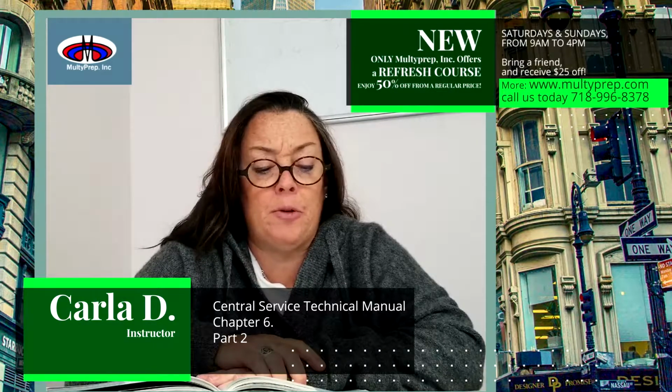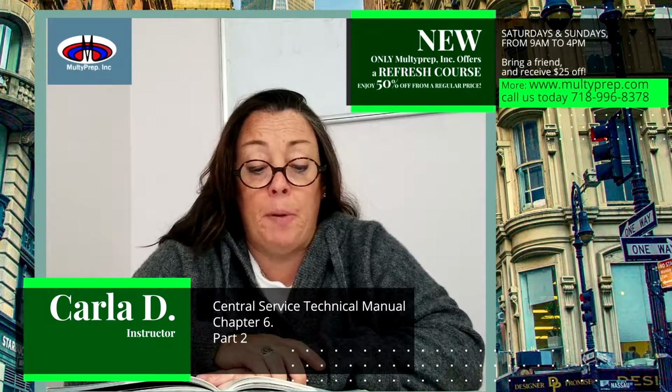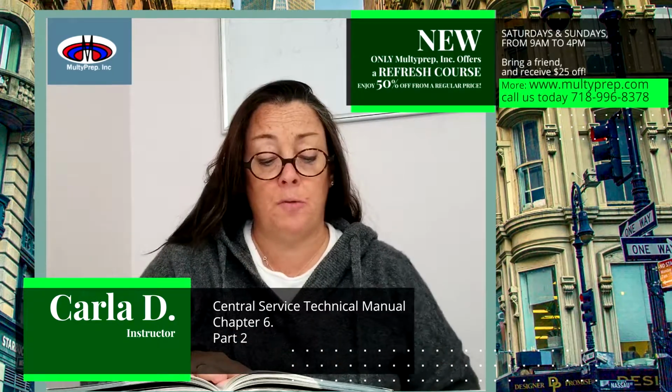Floors should never be swept or dust mopped because dust will rise and fall on items such as instruments in the area. When sterile packages are opened, the dust that has accumulated on them may fall onto the package contents. The decontamination area should have separate and dedicated cleaning equipment, such as mops and buckets. Items used to clean decontamination areas should not be used elsewhere.